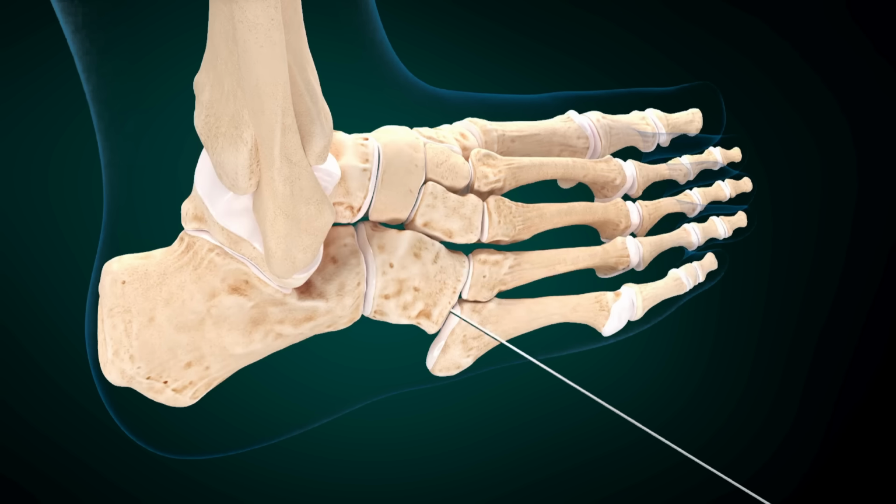A blunt guide wire is inserted in the sinus tarsi and advanced through the tarsal canal. This wire passes approximately 15 to 30 degrees off the perpendicular to the sagittal plane, going from anterolateral to posteromedial. This direction aims for the sustentaculum tali. The guide wire tents the skin medially.